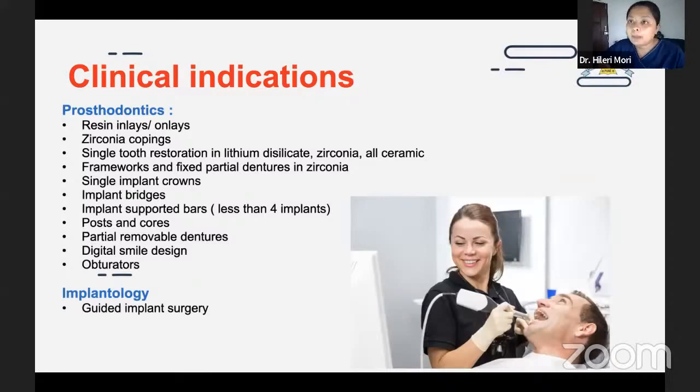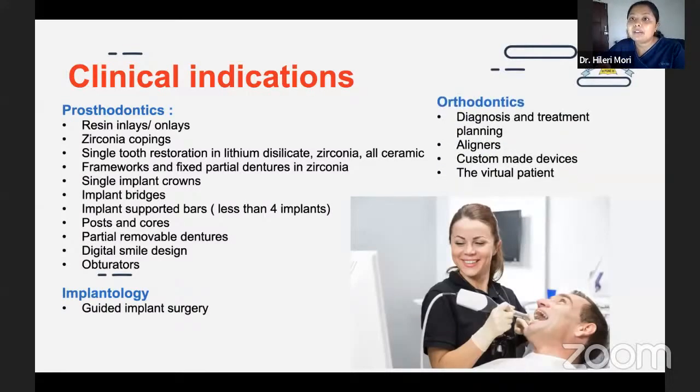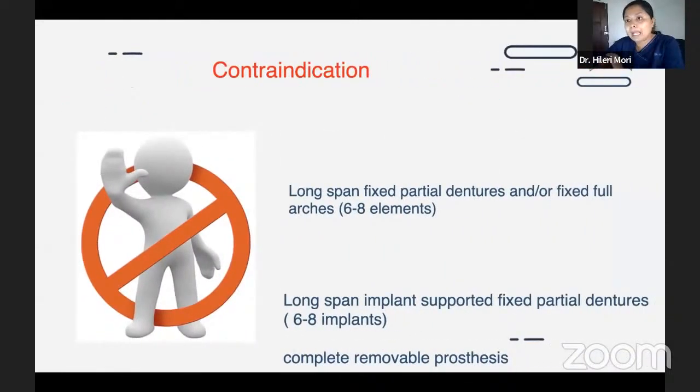It can scan your preparation. And in implantology also, guided implant surgery is very much possible with digital dentistry. Also, intraoral scanners are used in orthodontics for diagnosis and treatment planning, for aligners, for custom made devices, and as a virtual patient. Like in ortho, it has a huge role when it comes to digital dentistry. It eases your treatment planning and your diagnosis part very well.